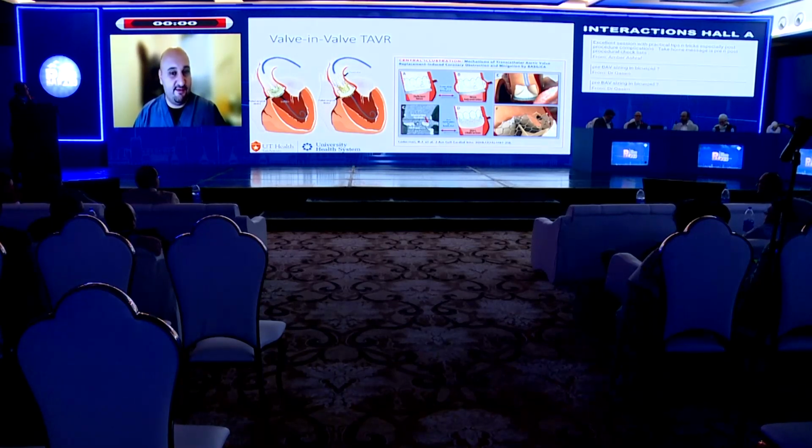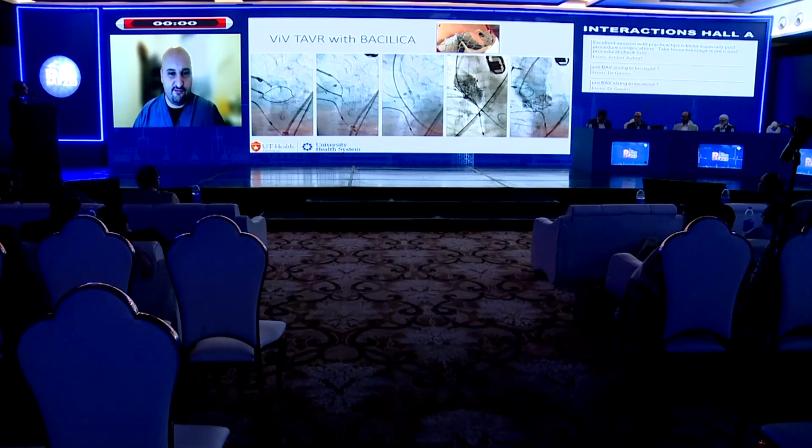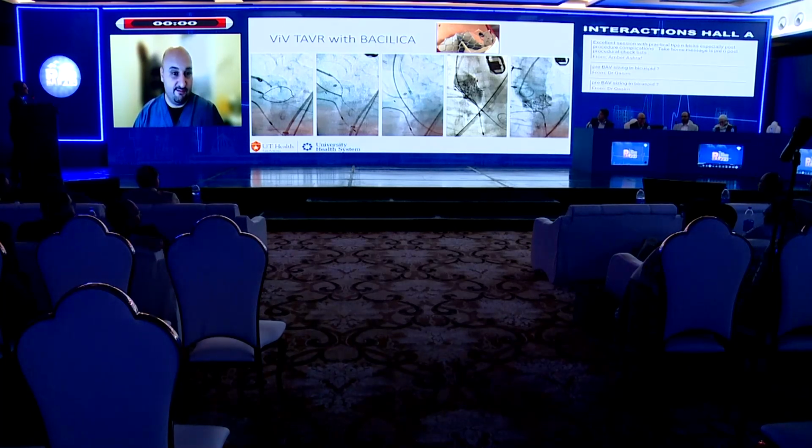The BASILICA procedure. I know Dr. Hakim did a recent BASILICA procedure in Karachi, which was a huge step, and congratulations for that. This is an example of how BASILICA mitigates the risk of coronary obstruction by splitting the leaflet and then you deploy the valve. This is for when the surgical valve is in place in a way, with low coronaries, that is not optimized for future TAVR, which is something surgeons are now paying attention to and doing a much better job.